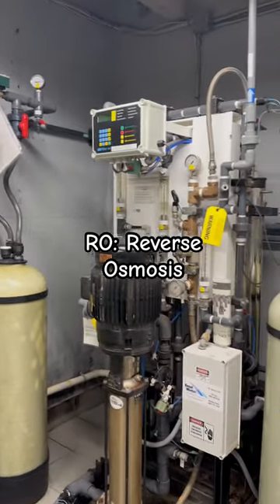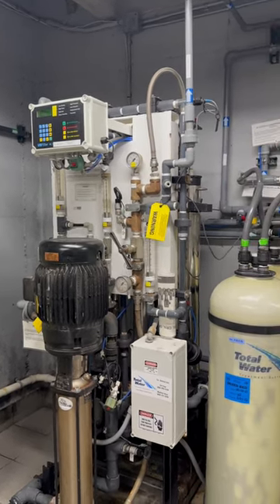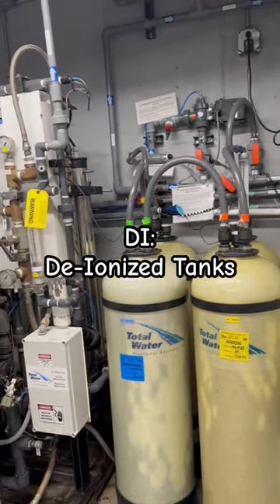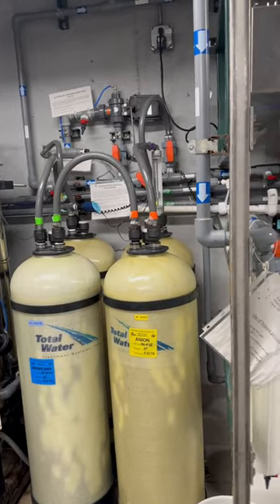Next, the water goes through the RO pump — the reverse osmosis pump. If this ever breaks down, we have a backup system: the DI tanks. We can push the water through there instead of the RO pump while we're waiting for the RO to be serviced.